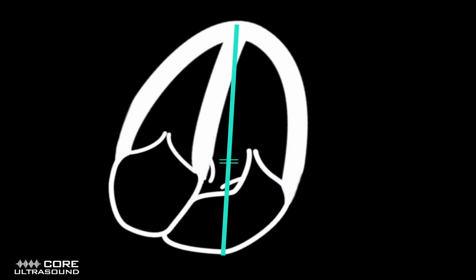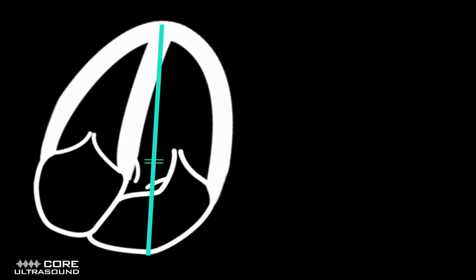Once you get that view, you're going to place your pulsed wave Doppler over that area, and you want the gate, those 2 little horizontal bars, to be just proximal to that aortic valve. The pulsed wave Doppler is that Doppler that makes that real cool sound.